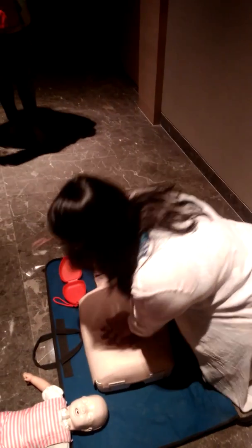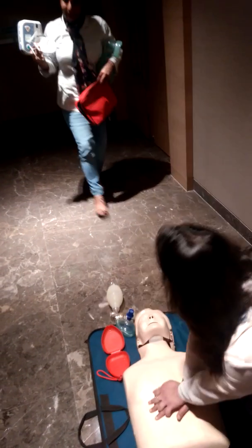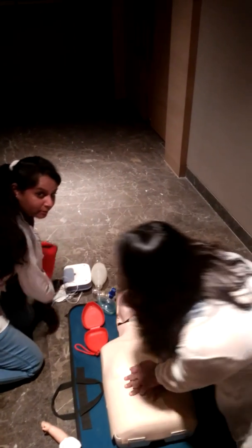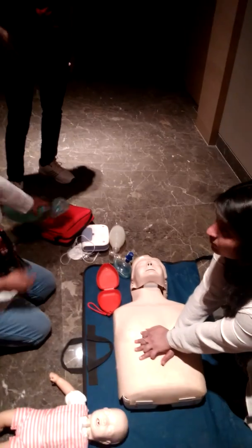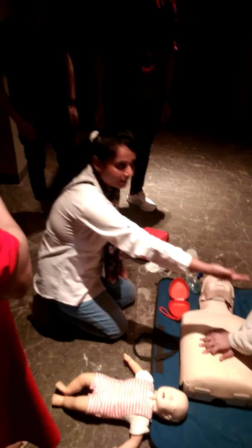Whenever you are bringing the AED to the victim, AED — Automated External Defibrillator — always come to the side of the victim and keep all these items at the head end, so that they can be operated by either rescuer.